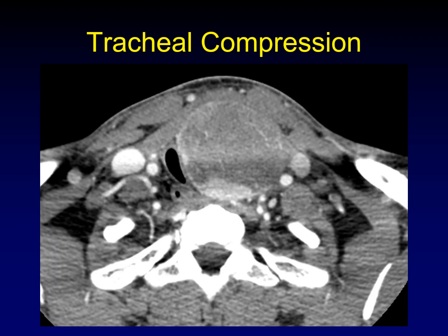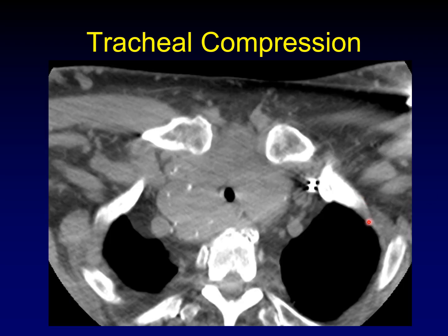Here's what I would consider moderate tracheal compression — we've got more of an oval or saber sheath configuration to the trachea now. There's still plenty of room for air to get in; I wouldn't expect this patient to be dyspneic from this alone, but it's clearly distorted. And once you get down to just clearly reduced diameter, then we start calling that severe tracheal compression.